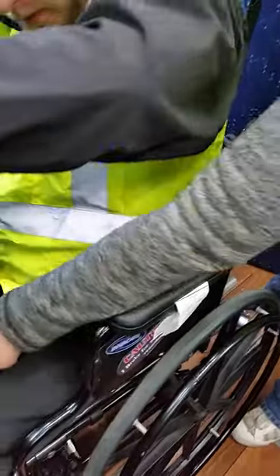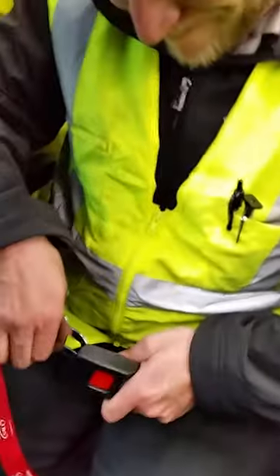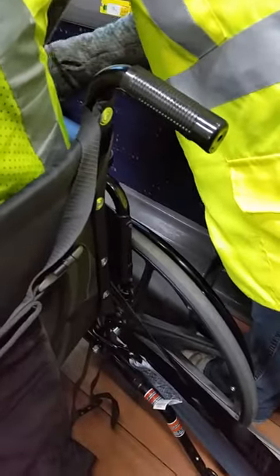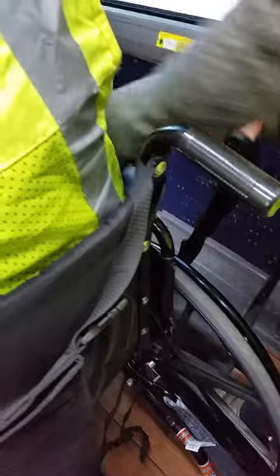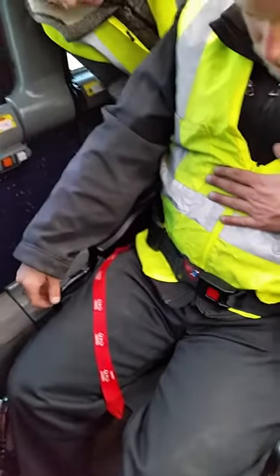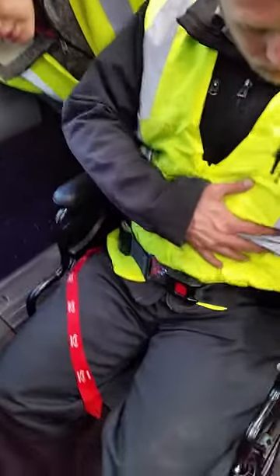And pull. And then you take it. You want to make sure that you've got the belt right in the middle of him. But you want to make sure that the red female end of the belt is over on his hip, because otherwise the lap belt is not going to go across.